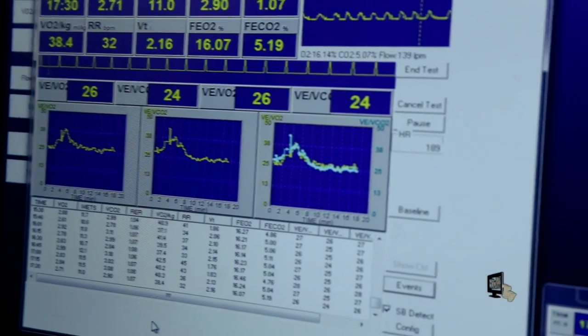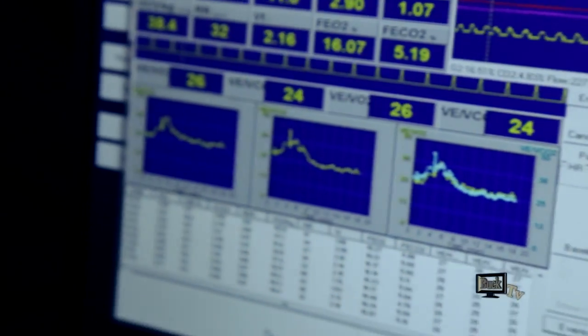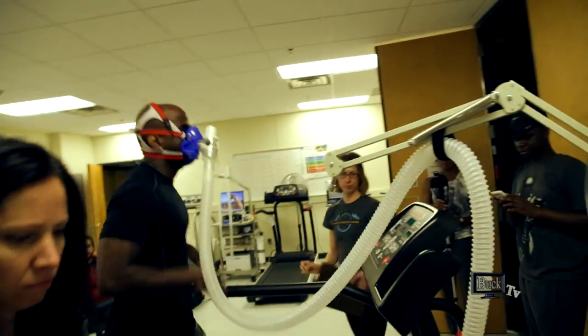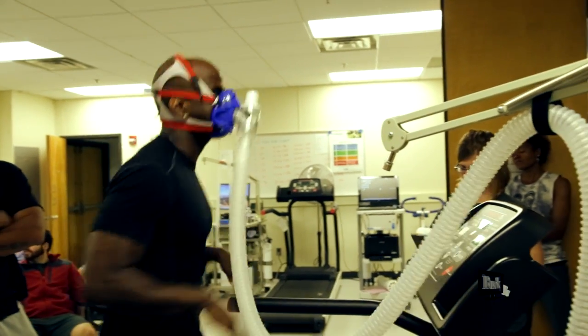Okay, Marshall, you were at a 12. Are you at 13? 13? Okay. And what's the heart rate right now? 188. Oh yeah, we just went up. But at the end of this... 192.